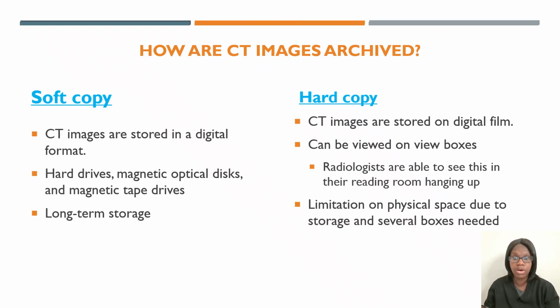And then you have hard copy. So your CT images are stored on digital film with hard copy. So for hard copy, just think of film. A film is hard. So that's how the images are stored. It can be viewed on a view box.